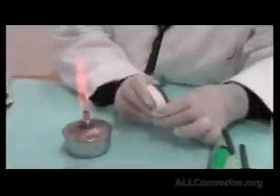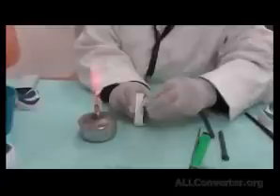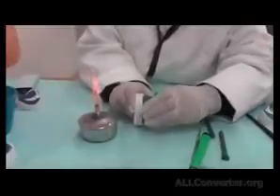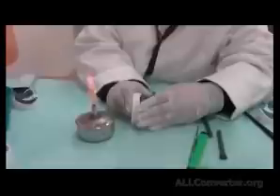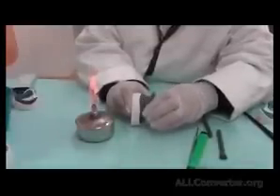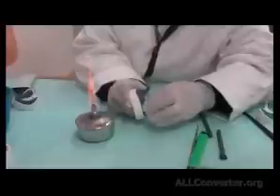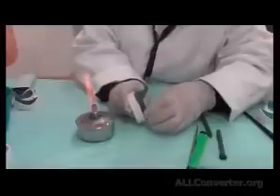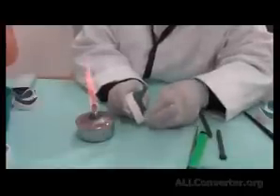Then, if the patient's case, I hold the cheek and begin pushing the cheek downwards and pulling it to the inside and pulling it downwards, so I could record the functional depth of the sulcus. For the cast purpose, it's enough just to press by your finger, making sure that the green stick went into the sulcus inside.